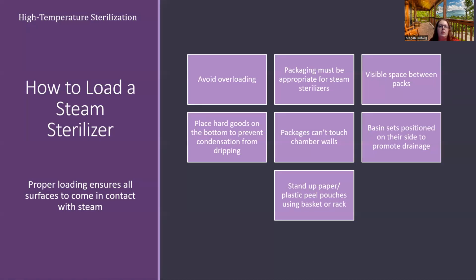Now, this is just as important as knowing times and temperatures, because you could get the right times and temperatures on these steam sterilizers, and you've maybe loaded it improperly, which is going to fail the entire load. So every step of this is important, right? Overloading is going to be one of the main causes that these packs fail or do not get sterilized properly. Trying to put as much in there because you don't want to run another one, right? So don't overload it. It won't allow the steam to contact all areas, which will be ineffective.